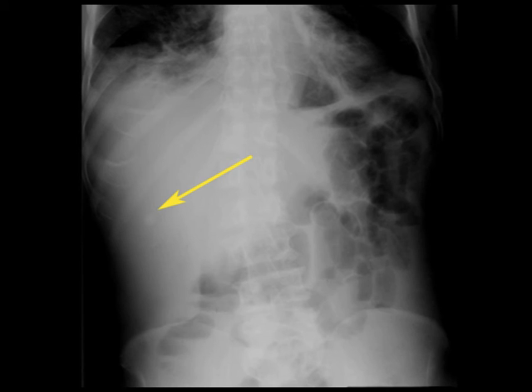And you want to be very careful not to mistake it for something inside the patient. So this is an example of an accessory nipple simulating a gallstone or a kidney stone.